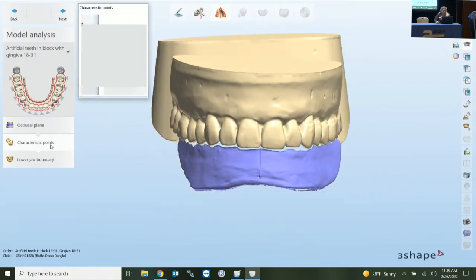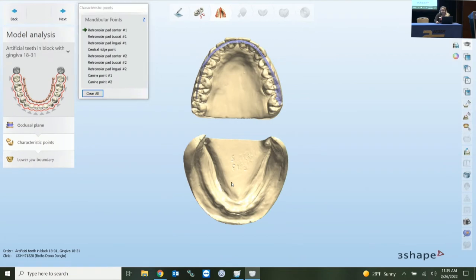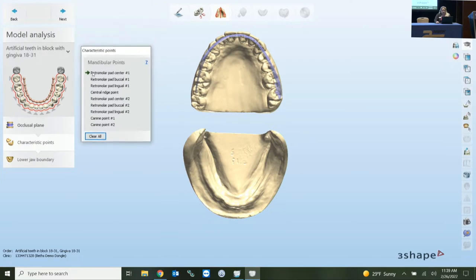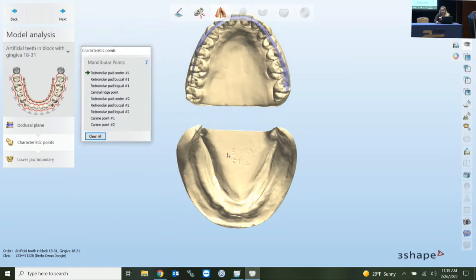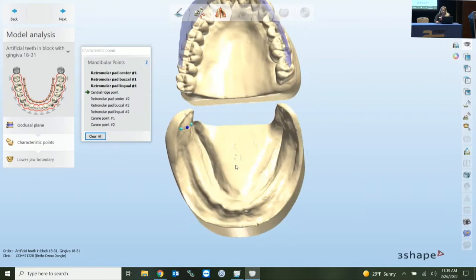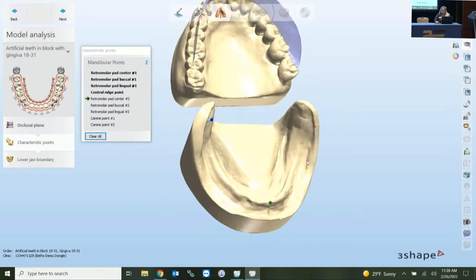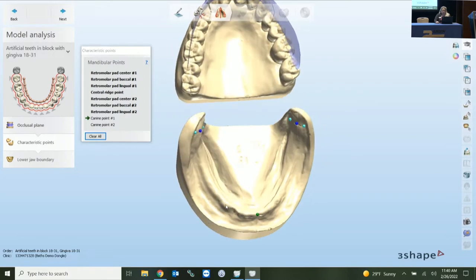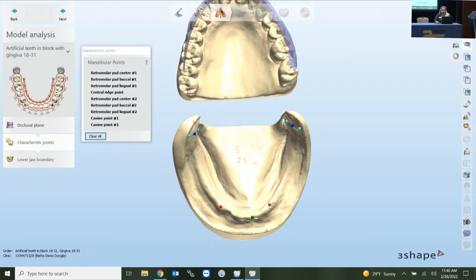Down in the characteristic points section, this is where you identify those characteristic points. 3Shape gives you a box where you're working top down, telling you what it wants you to mark first. So we go retro molar pad one, then the buccal side, the lingual side, the central ridge point, and then the patient's left side. It bolds the selections as you select them, then we go to K9.1 and K9.2.